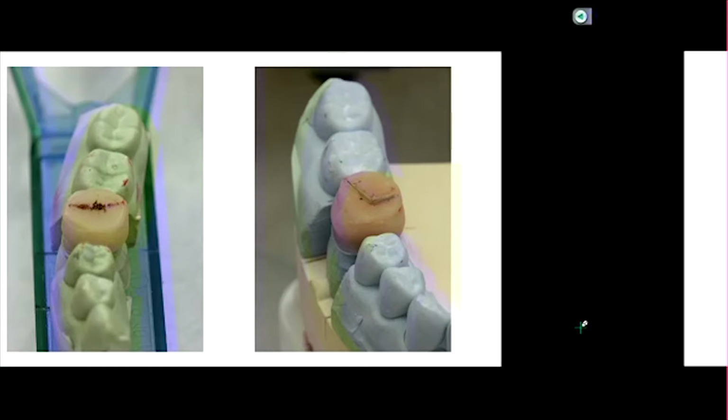As you move your jaw to the non-working side, the opposite side, that distal lingual cusp of the maxillary molar passes through the buccal cusp of your mandibular tooth, right? So if we want to design our mandibular tooth to allow for that cusp to pass through, we want to know exactly where that cusp is going to go. Okay. So you can see that if we use a triple tray, the information in movements doesn't seem to be as accurate. Okay.